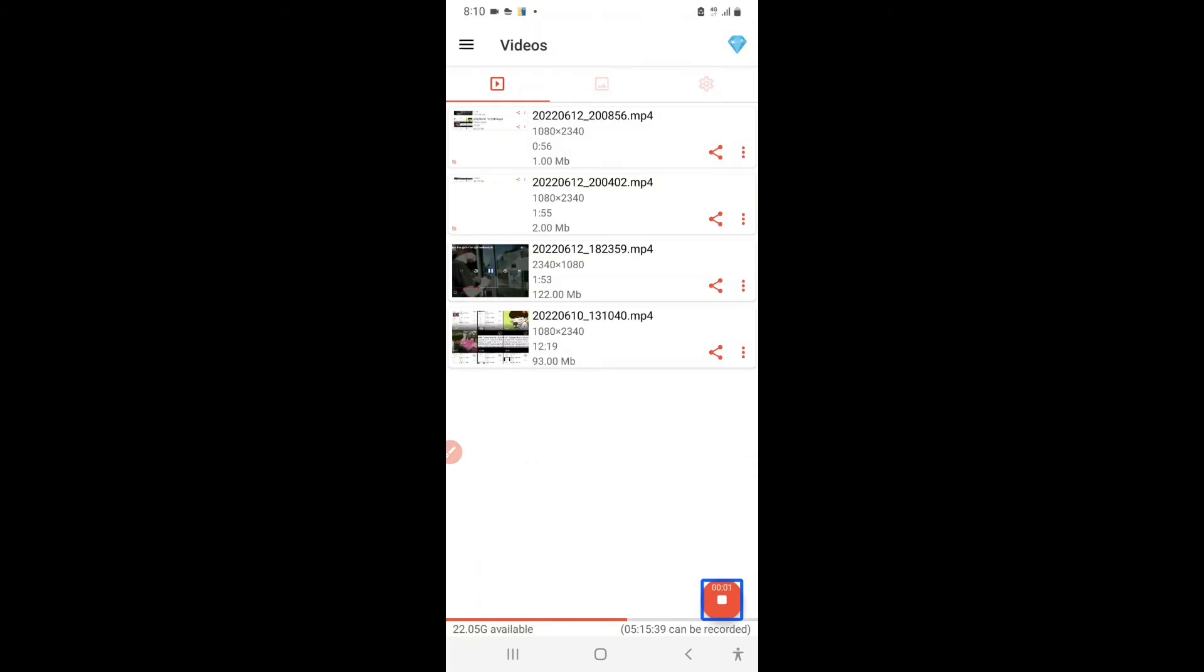So now let's speak about differences. Speaking about differences, Envision glasses has this feature wherein it can describe images. Okay? So if you are walking on a road, you could click a picture of the scene in front of you and it will describe the scene. So let's see Envision glasses doing that, whereas OrCam cannot do that.